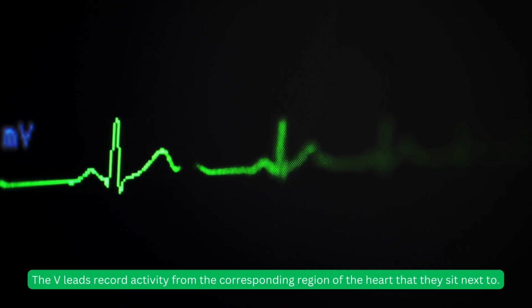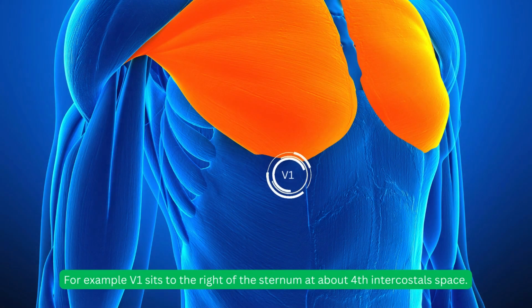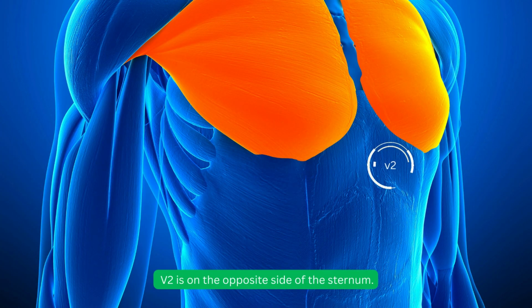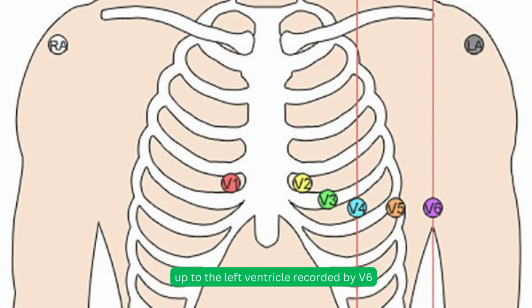The V leads record activity from the corresponding region of the heart that they sit next to. For example, V1 sits to the right of the sternum at about the 4th intercostal space. That is over the right ventricle. V2 is on the opposite side of the sternum. V3 is lower and lateral to V2, corresponding to the septal region of the ventricles, and so on, up to the left ventricle recorded by V6.